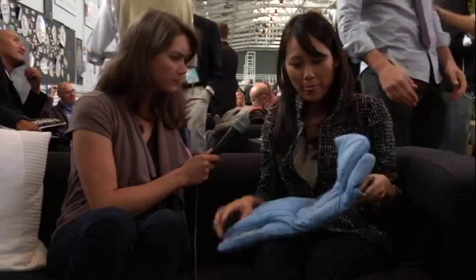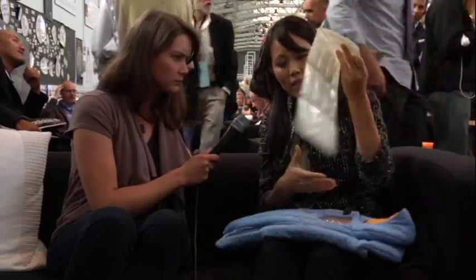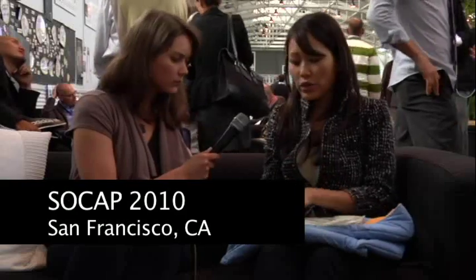So what my team and I have been working on over the last 2 years is the Embrace Infant Warmer, which looks like this. So it looks like a little sleeping bag for a baby, but the key is this pouch of what's called a phase change material. It's a wax-like substance that has a melting point of 98 degrees Fahrenheit, human body temperature, and you can heat this either with a hot water heater or with an electric heater. But the key is it takes about 20 minutes to melt. Then once melted, it stays at the exact same temperature over the next 4 to 6 hours.